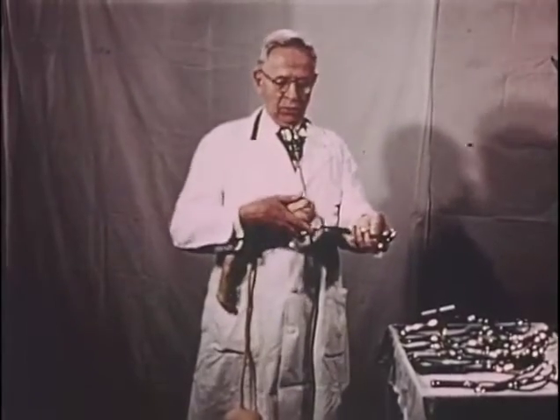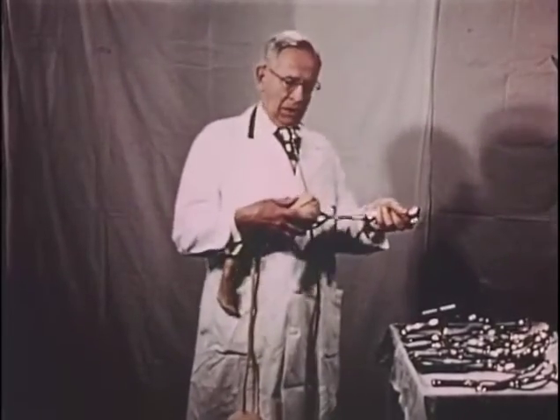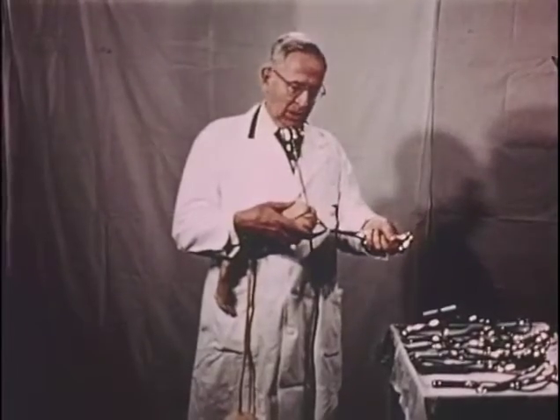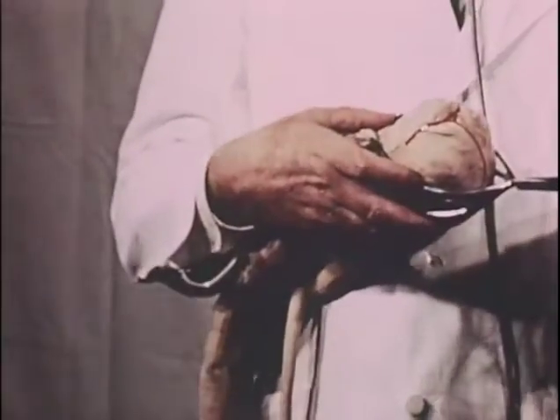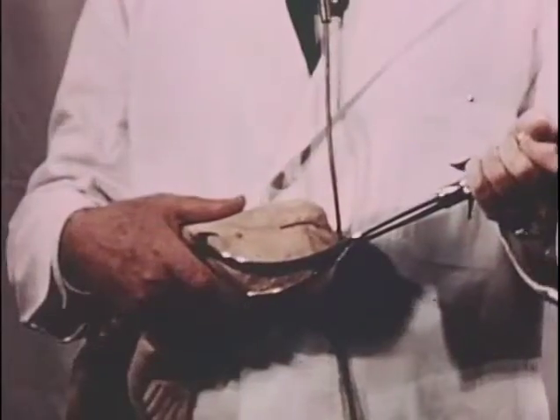The posterior fontanelle is more than a finger's breadth anterior to the plane of the shanks. We have the extended attitude of the forceps on the head. The blades move forward on the face and the toes dip backward beyond the angle of the jaw.